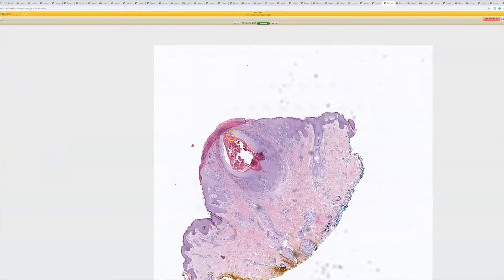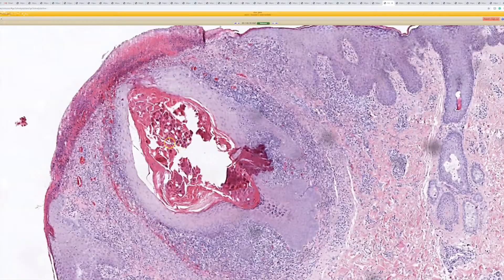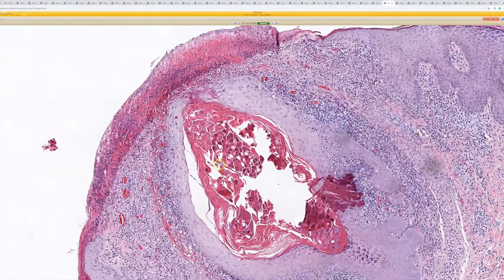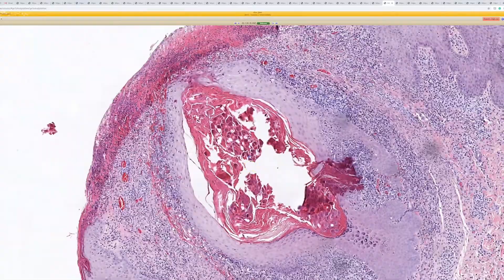This one was good for molluscum. Molluscum can look cystic — it's one of those invaginated things that if you get a cut through the middle, you can see that umbilication, how it connects up to the surface. But if you cut just to the side of where it connects, it's going to look like a cyst.